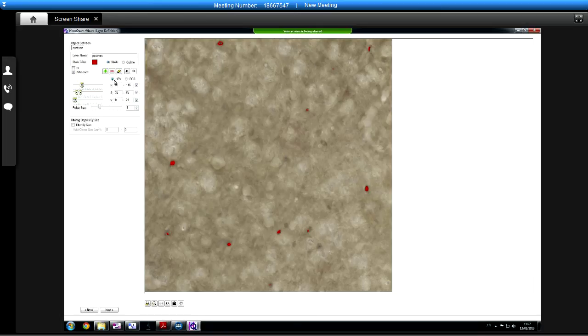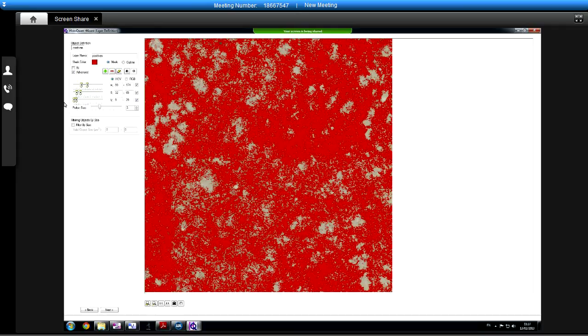Again, there's two methods, because you may find on some samples one method is better at pulling out the particular object of interest than the other. I find on a very high percentage of times HSV is the way to go, and I only ever start playing with RGB if I'm really struggling with HSV. But every time I click onto it, so if I click on completely the wrong thing here, you see these sliders are moving. It's coming up with a range of values for H, S and V that link to the colours you're interested in. So I've done something stupid there.